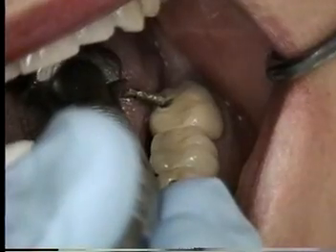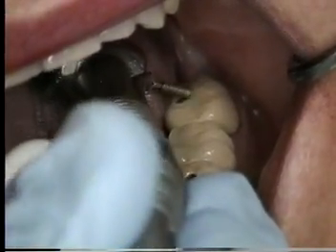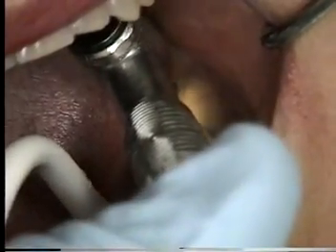This is a very thin area, so I know this is going to be too thin. The metal here is probably going to be paper thin. So I'm not going to use that metal to access it. I'm going to go ahead and move up here towards the mesial triangular fossa and remove the porcelain there.